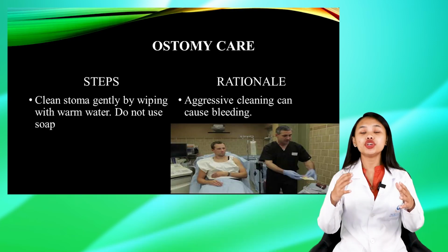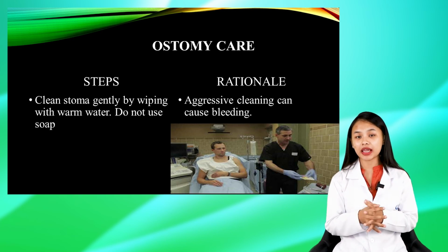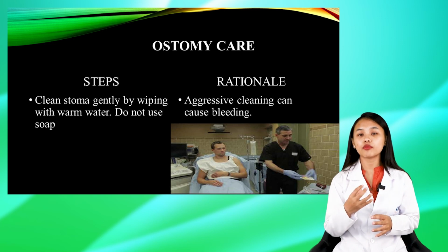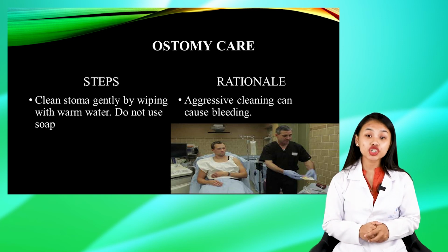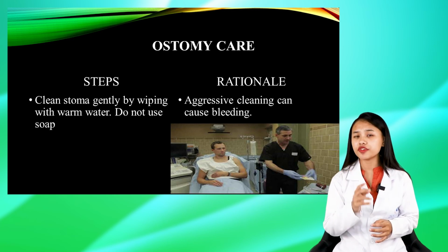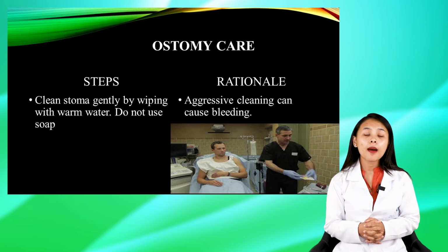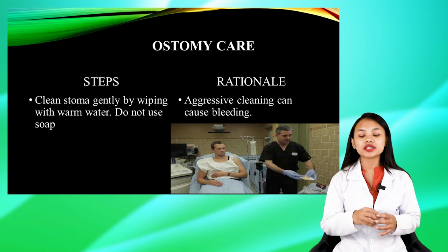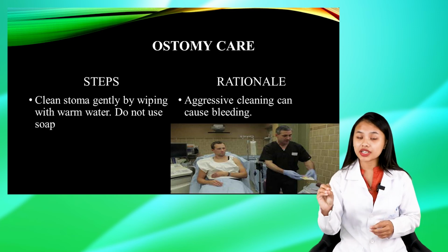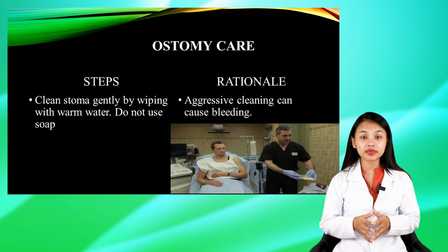So once the flange has been removed, you can then clean the stoma gently by using warm water. Here we must make sure that we do not use any soap. It is very important to know that cleaning of the stoma must be done gently, because aggressive cleaning can cause bleeding.